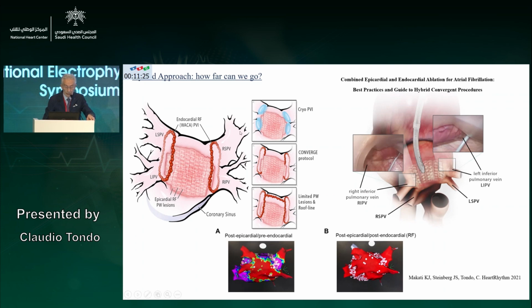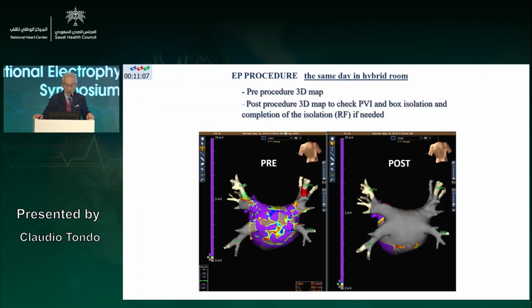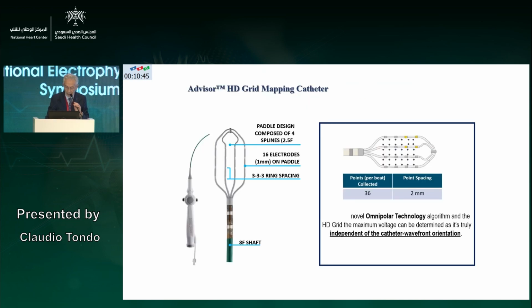at the most uppermost portion of the posterior wall, because of the pericardial reflection the surgeon cannot go beyond. So that is something that we do in the second step, when we do the endocardial ablation, just to complete, as shown in this slide, the isolation of the pulmonary veins, as shown on the right picture, and the left posterior wall. So this is just a way to promote epi and endocardial isolation of the left posterior wall.